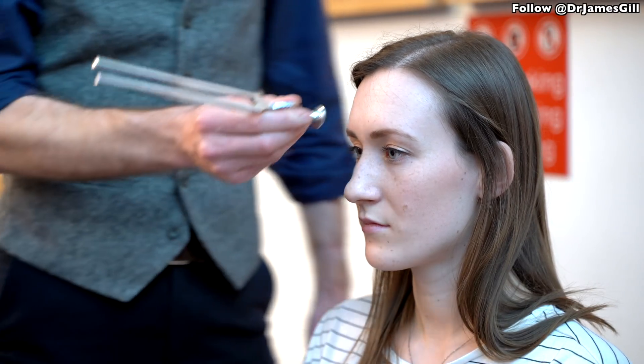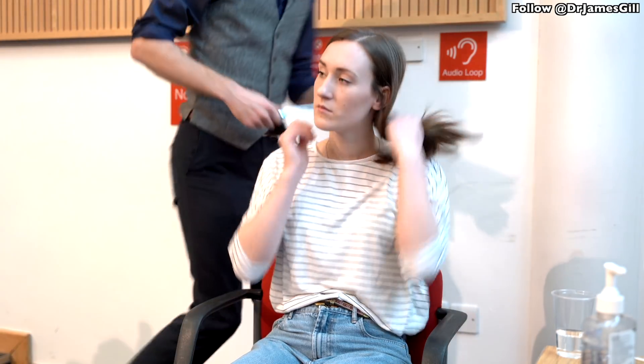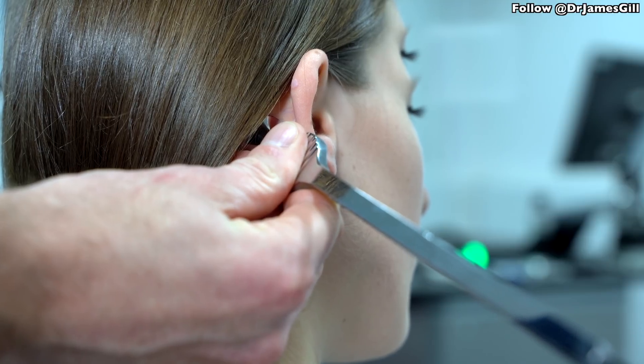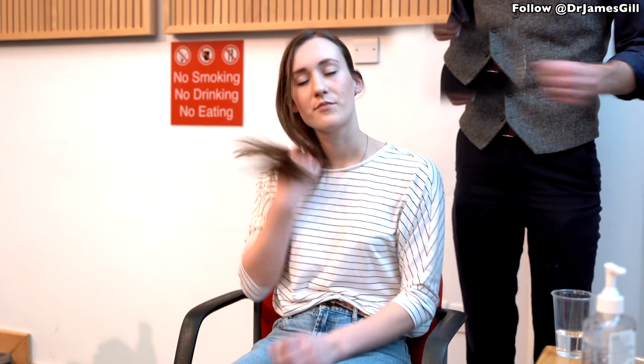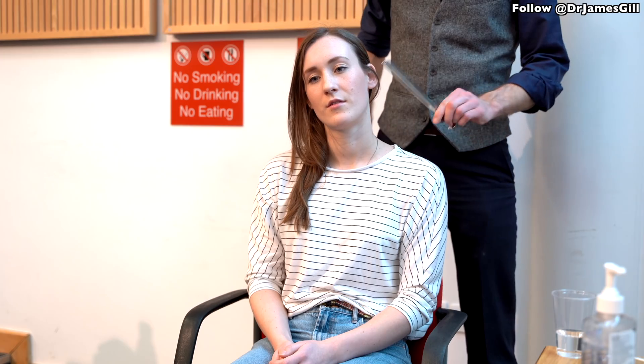The next thing we're going to do — I'm going to get this tuning fork, strike it, and put it on your forehead. I'm going to put this on your forehead and tell me where you can hear the noise — is it left, right, or middle? [Patient: 'Middle']. Super. So we need to do an additional test, which involves putting this on the bone behind your ear. When the sound stops, please tell me and I'm going to move it round to see if you can hear it then. [Patient indicates sound has stopped] Can you hear it now? [Patient: 'Yes']. Excellent. Same on the other side. [Patient: 'It's gone'] Can you hear it there? [Patient: 'Yes']. Excellent.